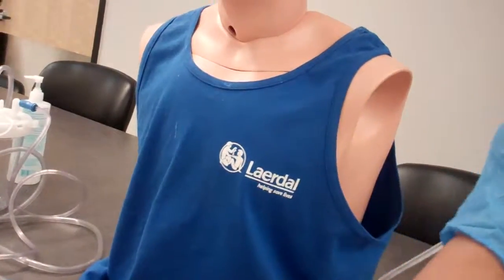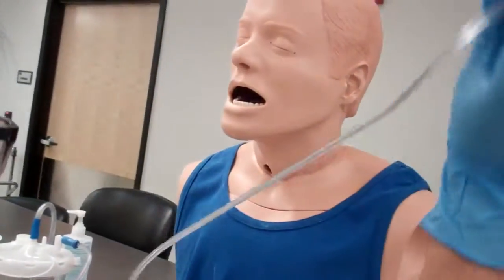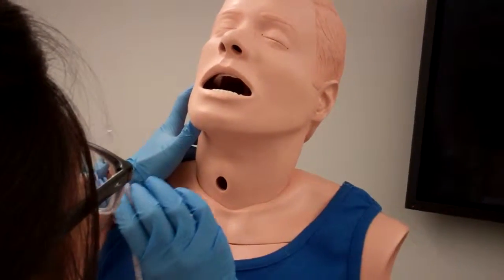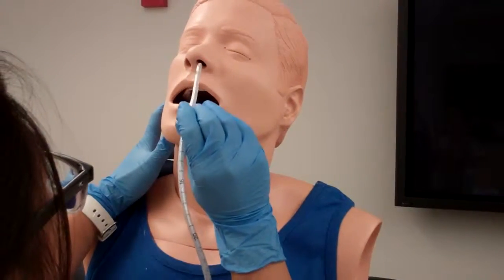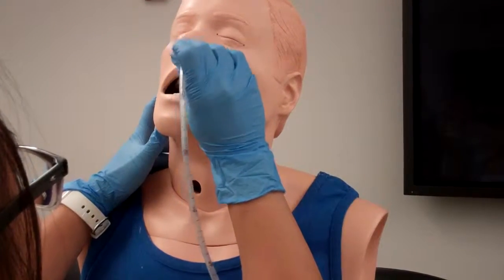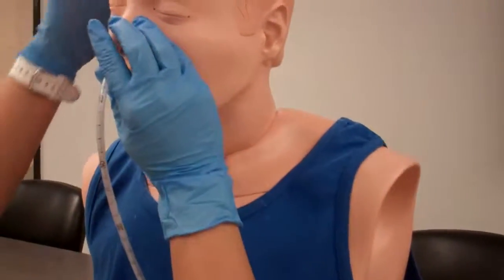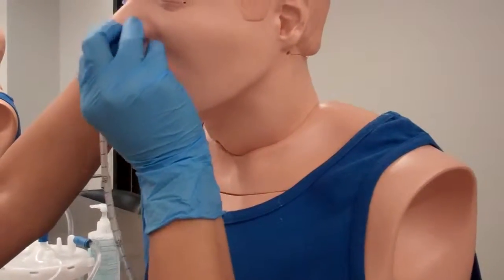Now I'm going to lubricate the top. And now I'm going to have my patient hyperextend their head. And now, Mr. Schumer, does it matter which nostril I insert it in? No? Okay, so I'm going to choose the left nostril. I'm going to insert it slowly. Okay, once I feel resistance, I'm going to have my patient flex their head forward toward their chest. I'll give them a sip of water to start swallowing as I insert the tube slowly, gently.